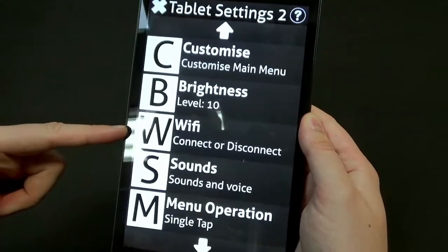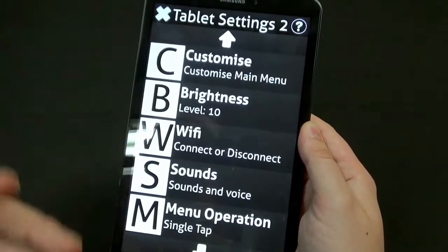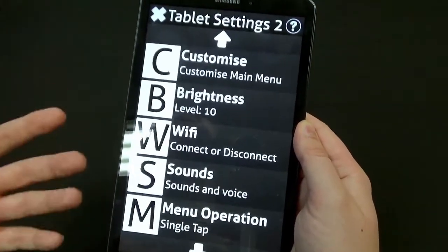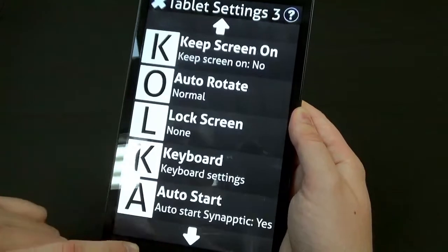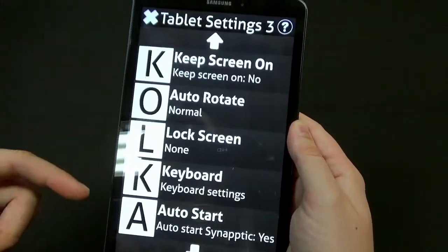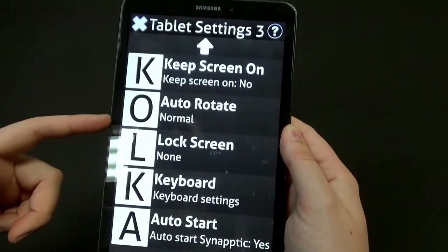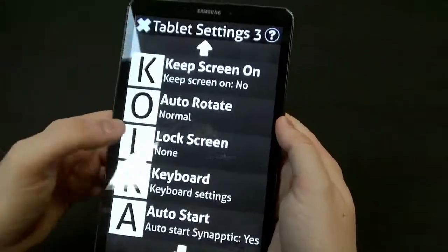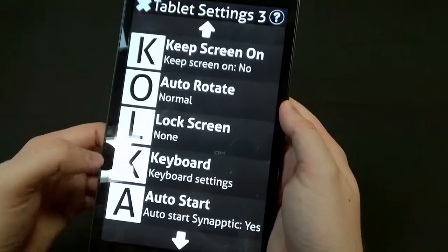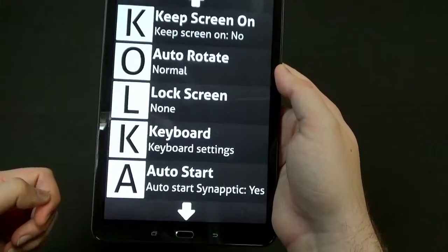You can control the sounds the device makes or the speech feedback — how much verbosity there is, in other words how much information is spoken to you. You can keep things on screen, enable auto-rotate so if you're typing you can rotate it to get a bigger keyboard, choose a lock screen, adjust keyboard settings, and have Synaptic auto-start if you want to.